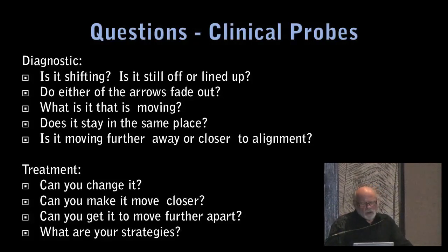Questions. Oh, is it shifting? Is it still off or lined up? Do either the arrows fade out? Suppression. What is it that's moving? No, it's not the arrows. Look, I take the polarizer. It's not the arrows. What's moving? All trying to get them to realize that they're in control.